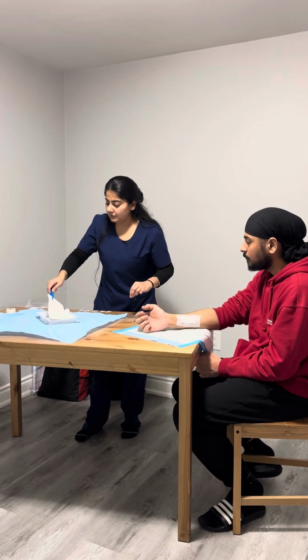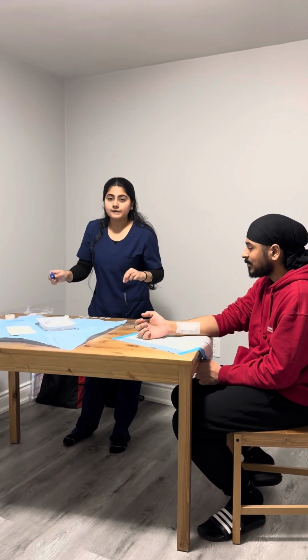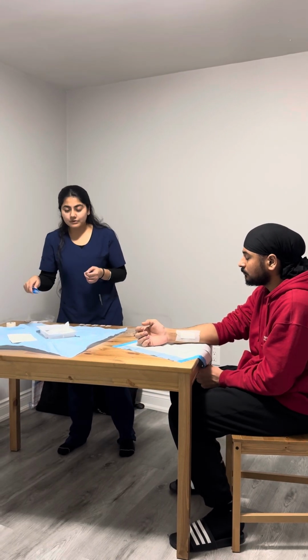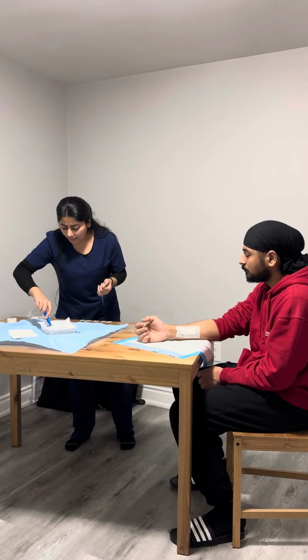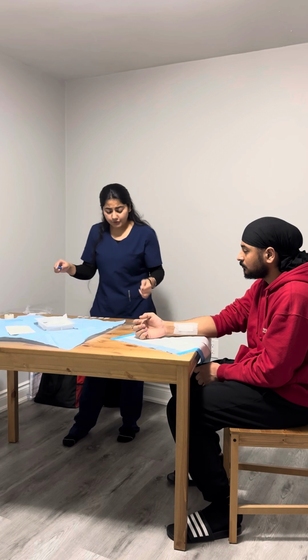This is the sheet. I'm going to use this one. I have 6 2x2 gauzes to clean the wound and then to dry the wound afterwards. I have 3 4x4 which I'm going to use to do the dressing for the patient. I have these 2 forceps which I'm going to use afterwards for the sterile procedure.